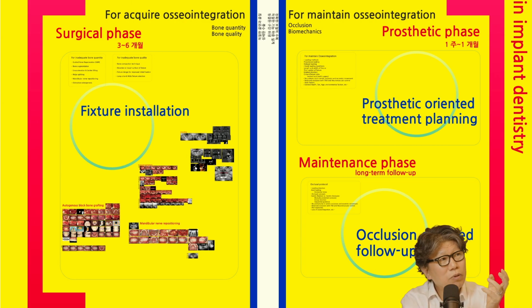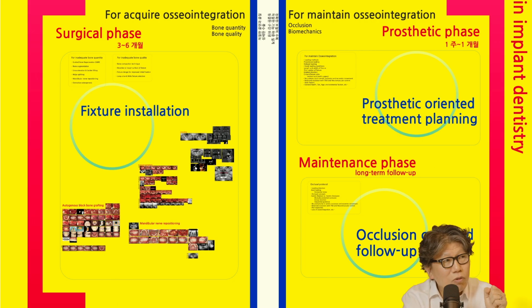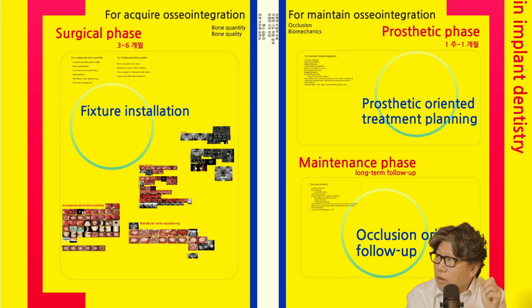I've had cases where it's taken almost a month or more to make the impression, then the abutment setting, then the temporization, then the final prosthesis. And then I'm explaining it like this. And then the last thing I'm explaining is, the implant is in and the prosthesis is done, but the actual bone attachment period is for the next month to a year.